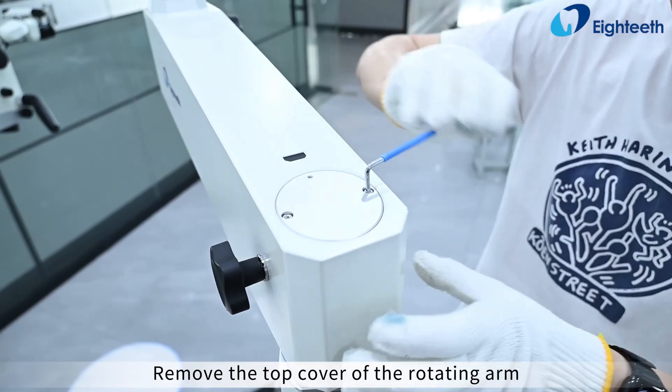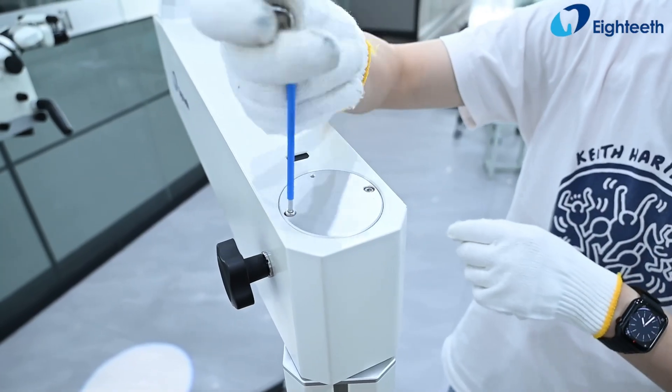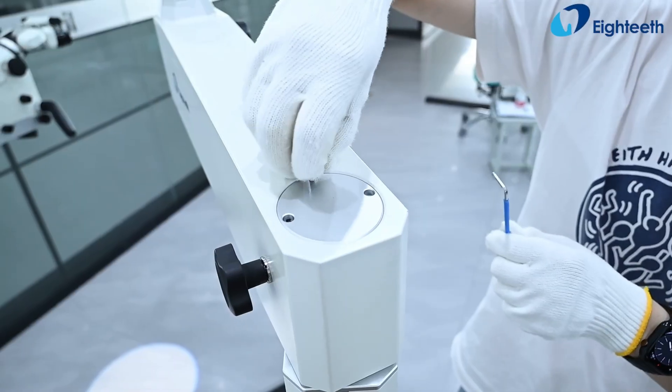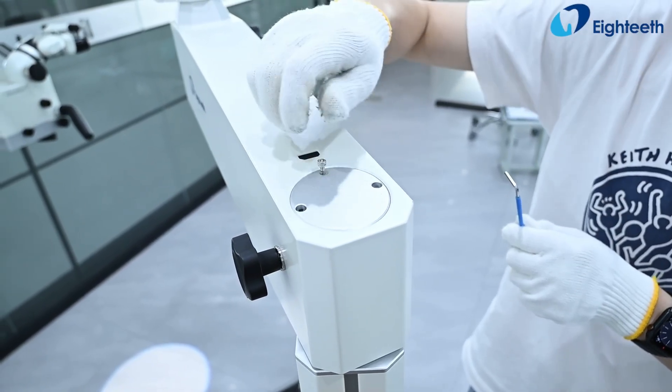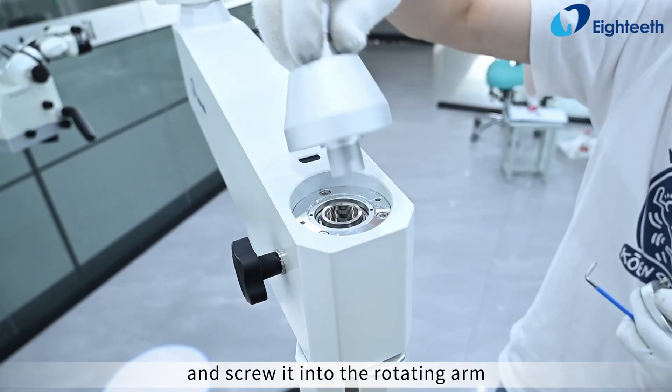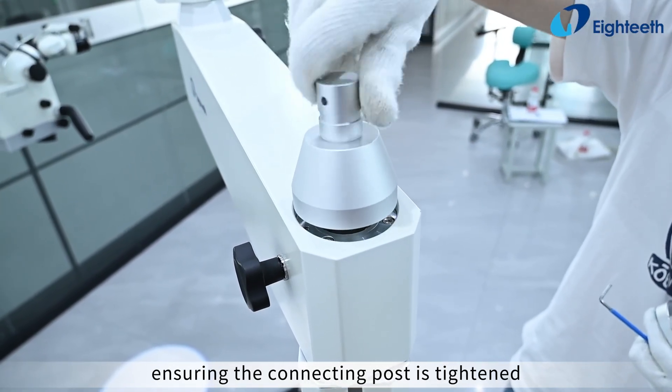Remove the top cover of the rotating arm. Take out the connecting post and screw it into the rotating arm, ensuring the connecting post is tightened.